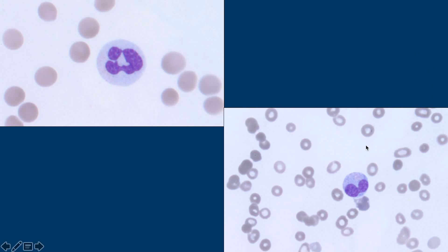So this here is your hyposegmented neutrophil. It still has segments — it's just like two of them. We'll talk about that a little bit more.